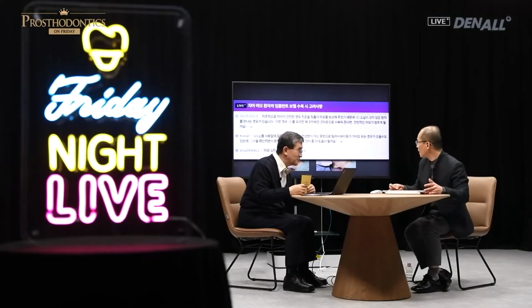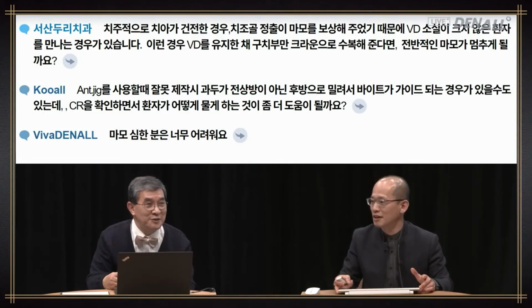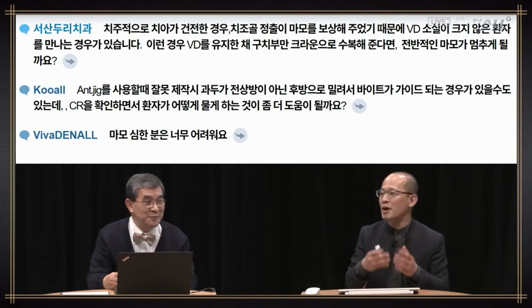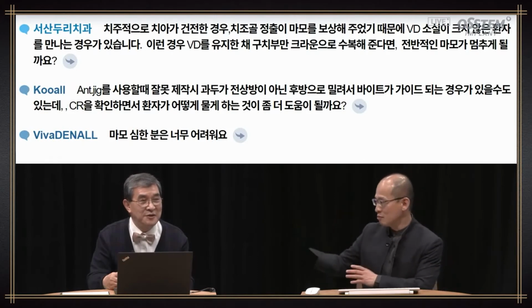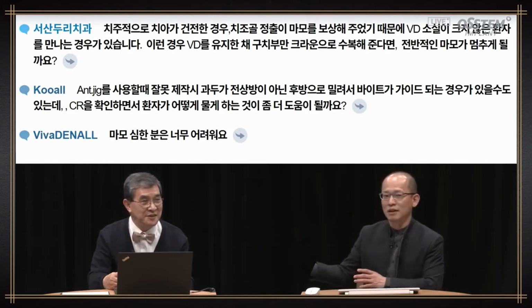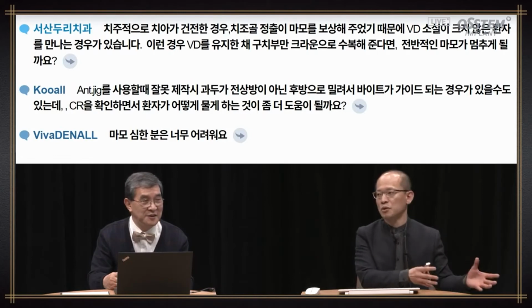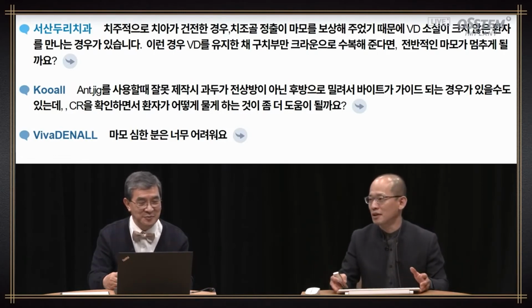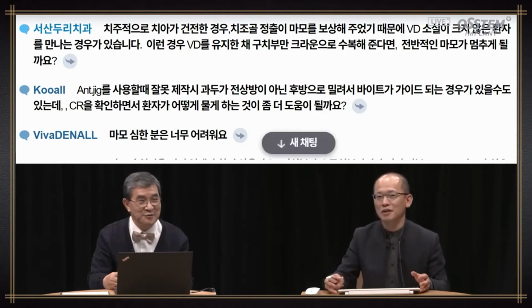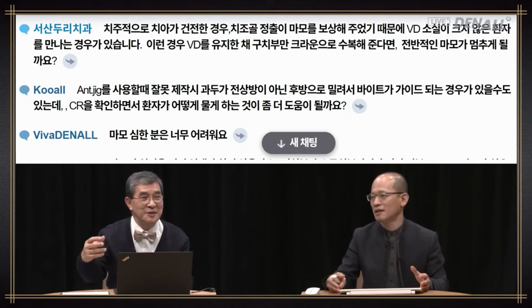Another question, if there's a lot of wear, it's really tricky. Yes, that's correct. It takes a lot of effort, and there are a lot of different things to be considered. And as was already mentioned, 10 or 15 years ago, the full mouth patient still requires repairs and continuous monitoring. Yes, you need a lot of repairs. That's correct.